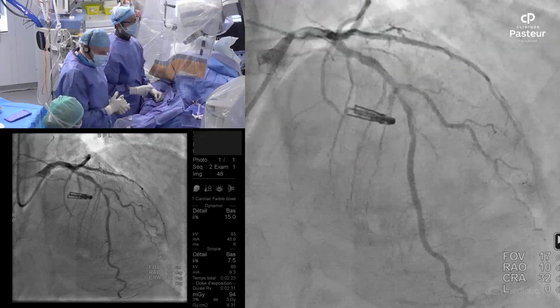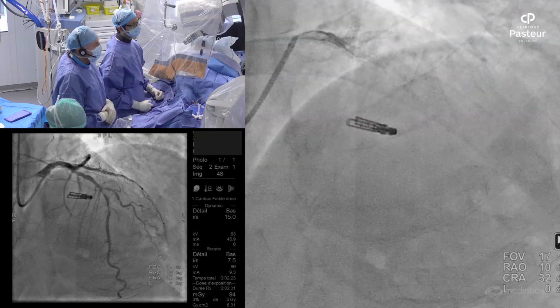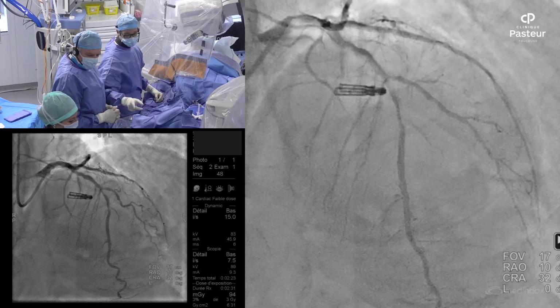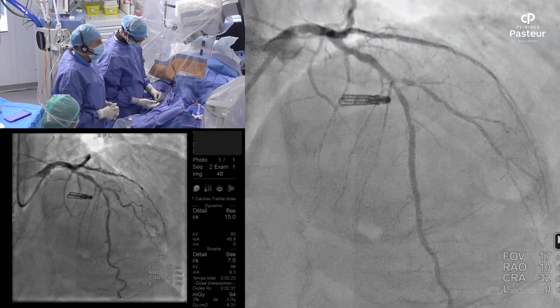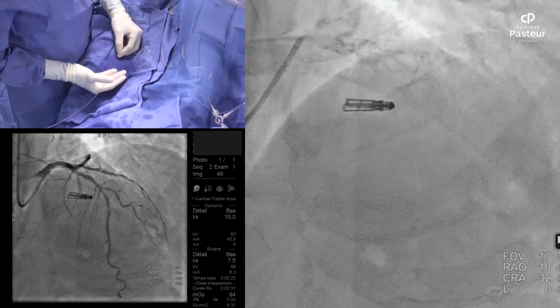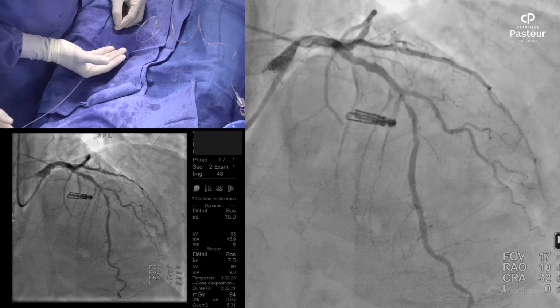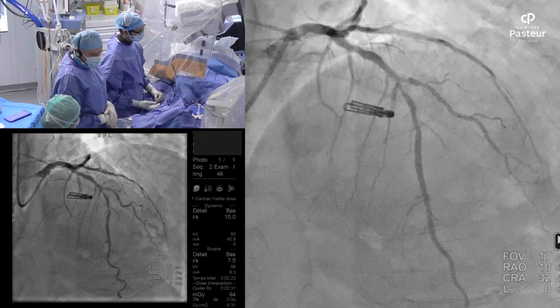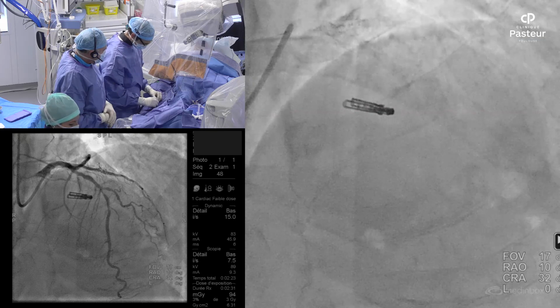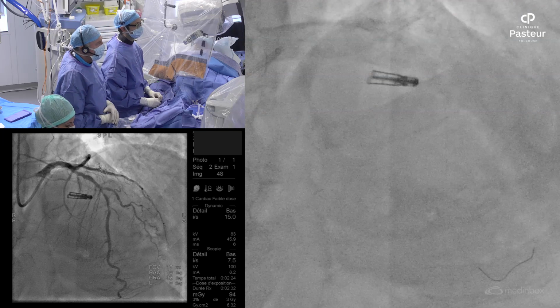And to go further in the discussion, in Clinique Pasteur, when we have a calcified lesion, we use atherectomy as a first step to prep the lesion and not as a bailout strategy. Maybe we can test the burr, please. So it's a 1.5 burr. Okay. Very good point. Another variable that should be considered is that rotablation is the safest way to address a bifurcation. It's very infrequent. I have never seen a side branch occluding after doing rotablation. So this gives you the possibility of keeping this side branch open during the preparation.